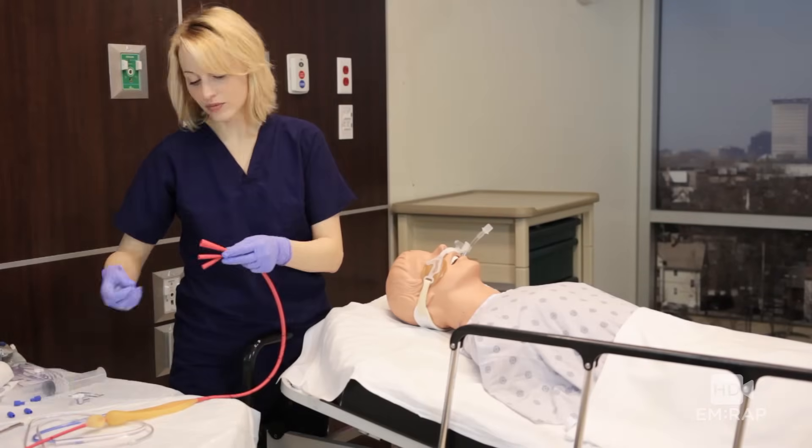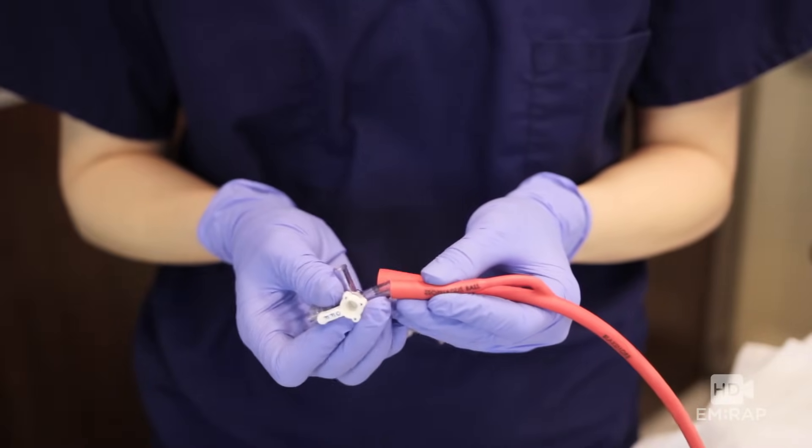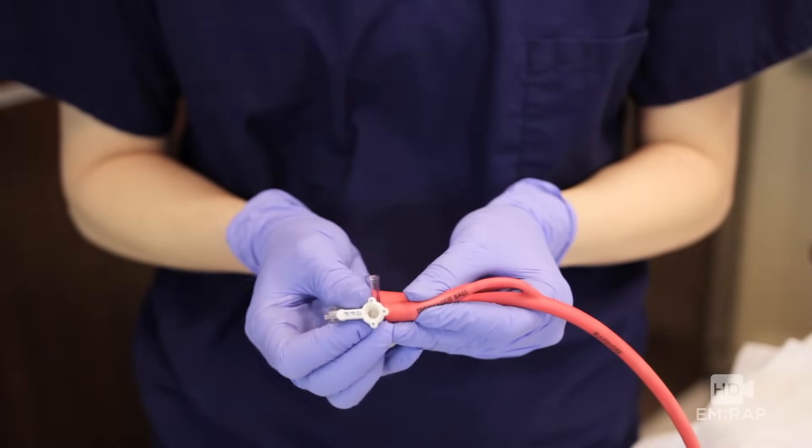Insert one three-way stopcock into the gastric balloon port, then take a second three-way stopcock and insert it into the esophageal balloon port — these should fit pretty snugly.